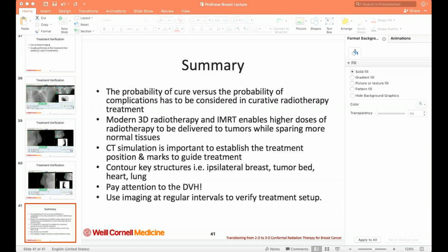Actually, I'm a physicist here with University of Medical Teaching Hospital. We're still waiting for a therapy machine. I'm really interested because I proposed to do my PhD in optimization on advanced radiotherapy. One thing I realized back home is about treatment verification, because most of the machines we have here in Nigeria don't have on-board treatment verification. What other options do you have for verification?